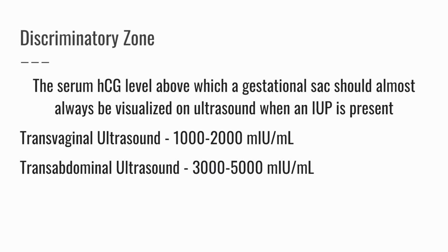However, some more recent literature has shown that depending on the operator, transvaginal ultrasound could be somewhere between 1,000 to 2,000 and transabdominal somewhere between 3,000 and 5,000.